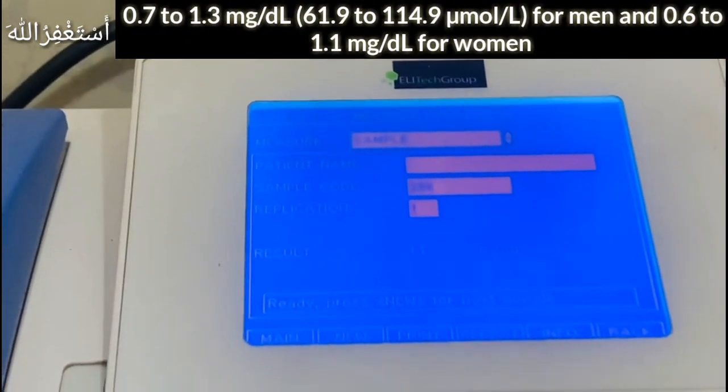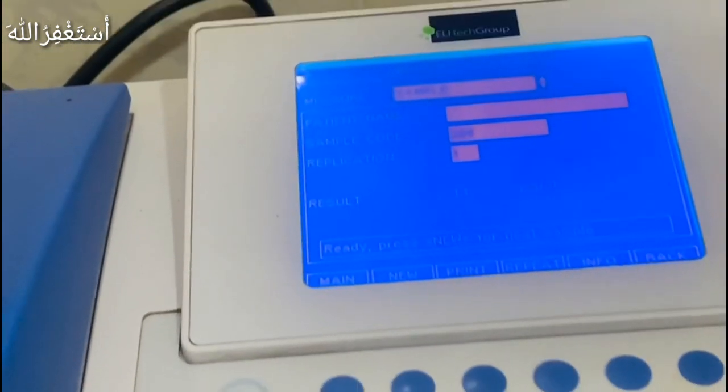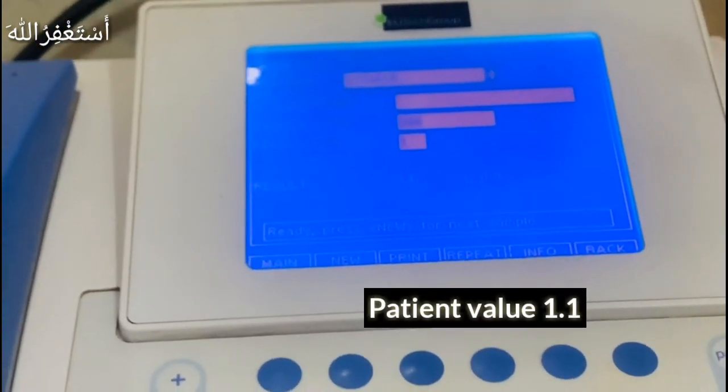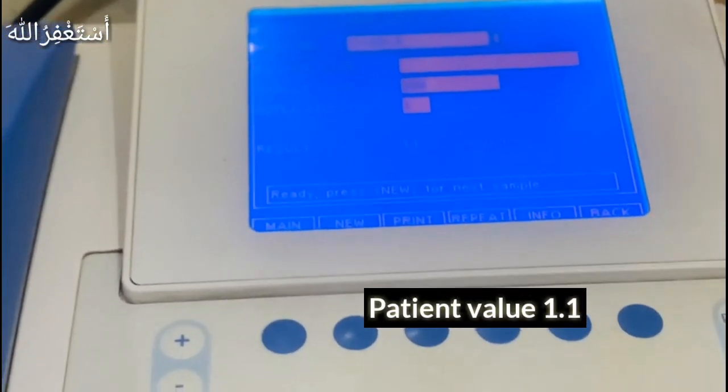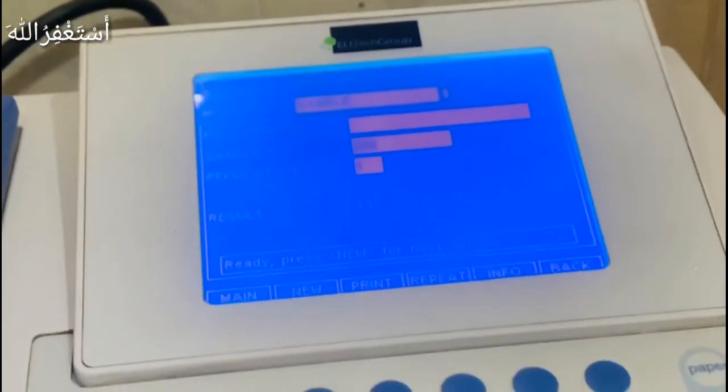You can see the result is 1.1 for patient one. This is called 1.2 — we have calibrated it and the calibrated value is set as 1.2. This is patient one's result: 1.1.